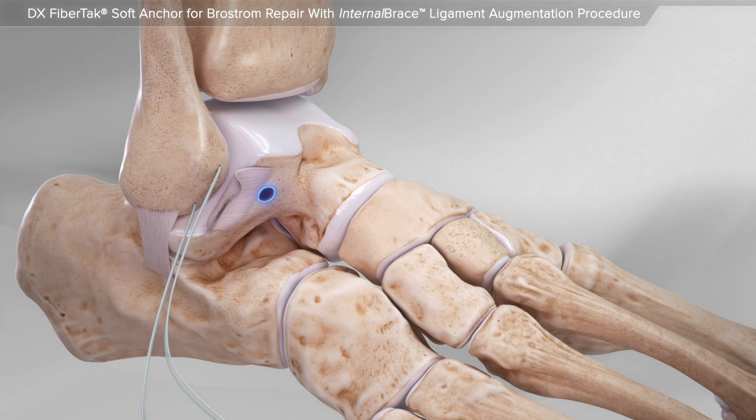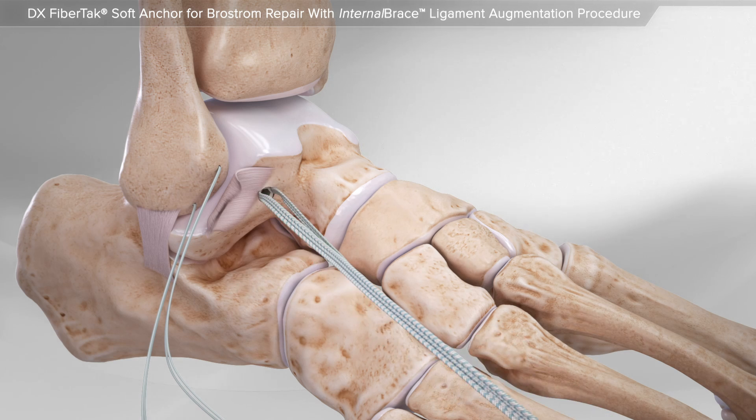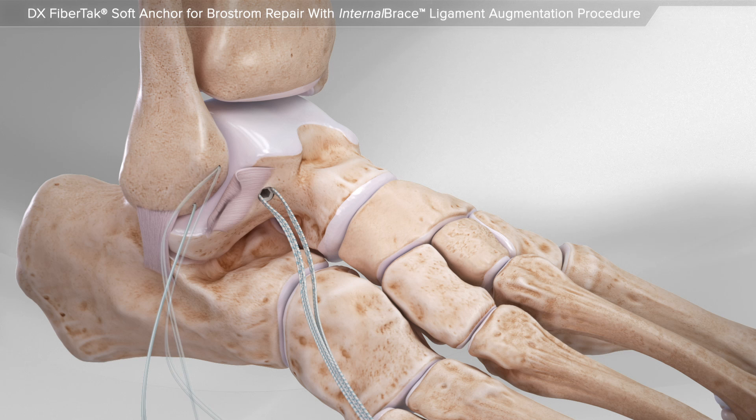Then an anchor with high-strength suture is placed into the bone below the torn ligament. This high-strength suture will be used as the internal brace ligament augmentation procedure.